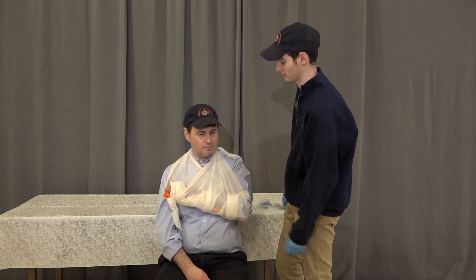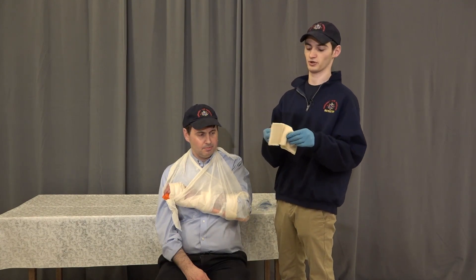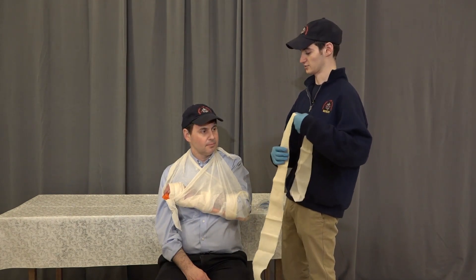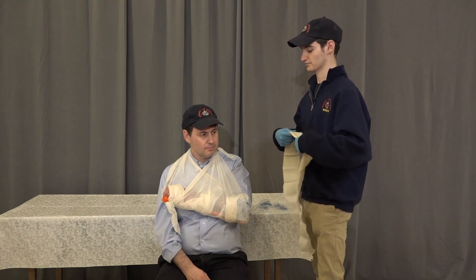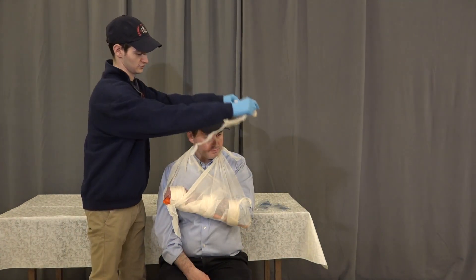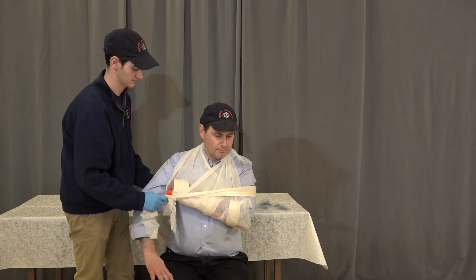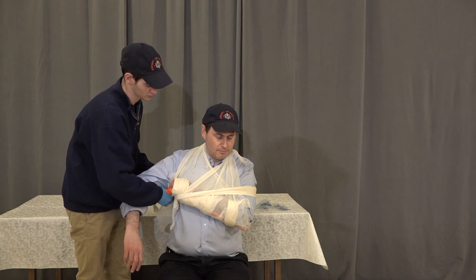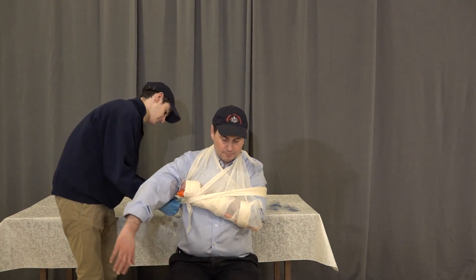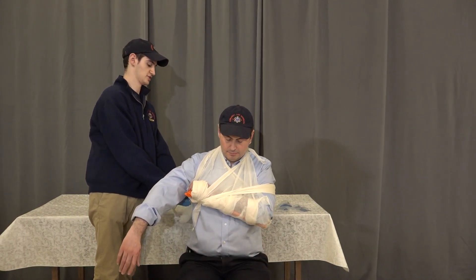So that's tied off. The last thing we're going to do with the triangle bandages is tie a swath across the chest to secure the arm to the chest and prevent it from moving as we transport the patient. We're going to come across the humerus of the injured side, catch the board making sure not to come directly over the site of the injury, and tie on the uninjured side of the body.